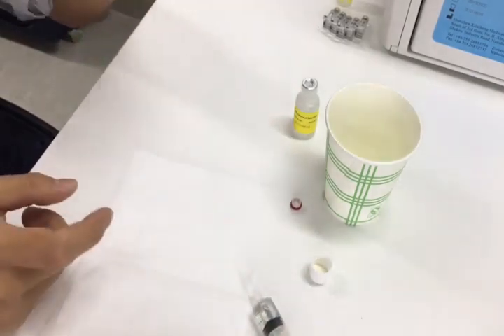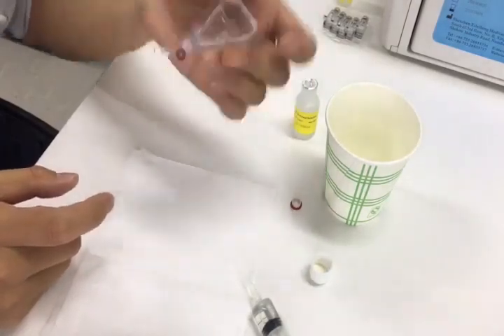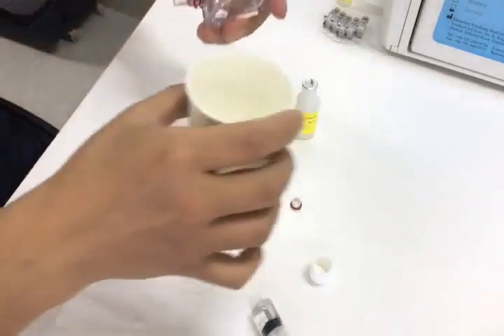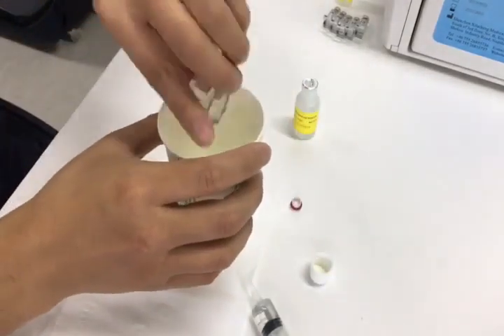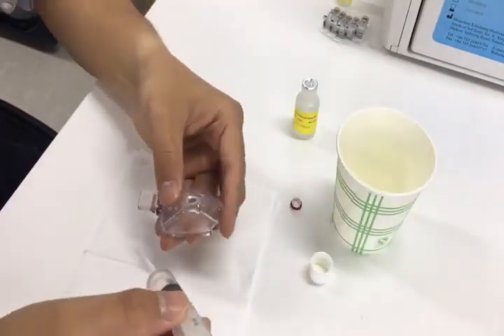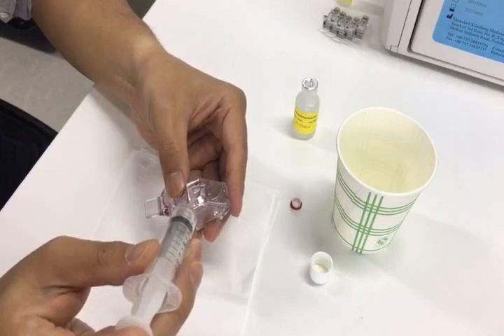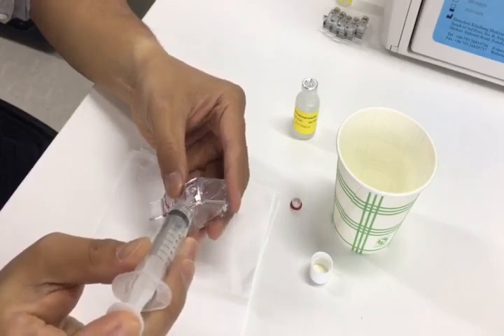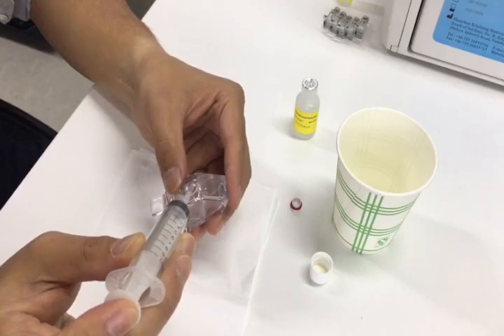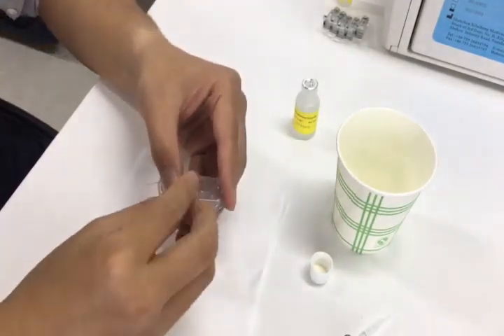We need to clean the inside, so clean for a while, then remove the solution out. Then add the rest of the solution into the cavity. Put the volume to two-thirds of the cavity. Then close the cap.